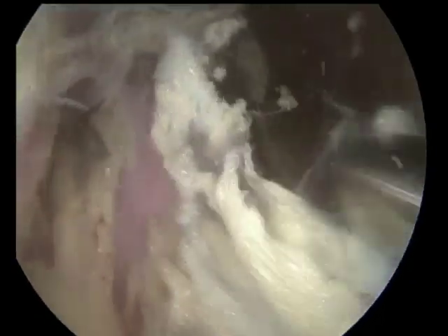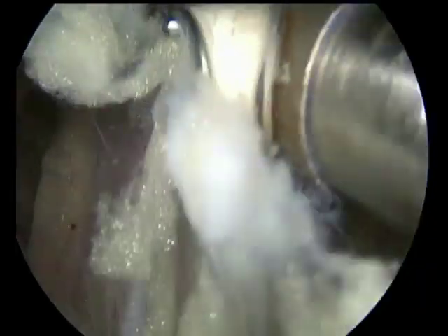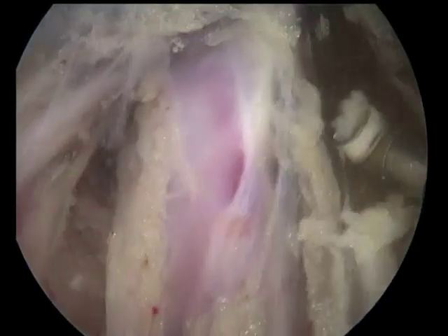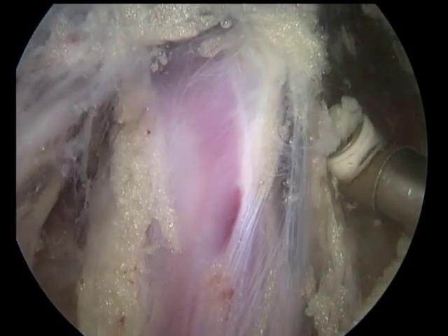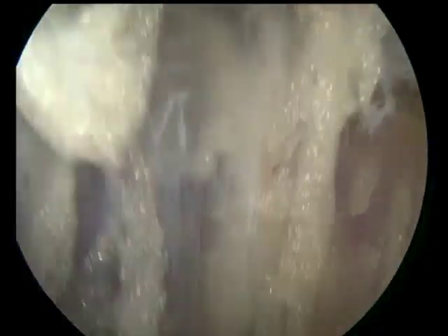Then we create additional lateral portal. We switch the instrument into the lateral portal. Then we switch our scope with the help of switching stick into the median portal. And this gives us better visualization of the sciatic nerve and of this area. We can see the inferior gluteal artery and pulsation of it.